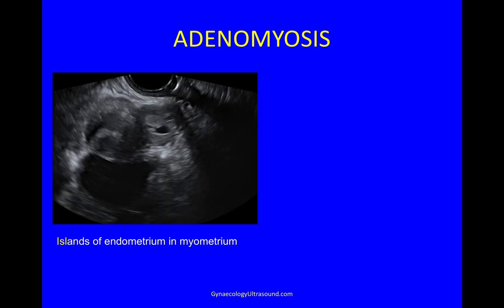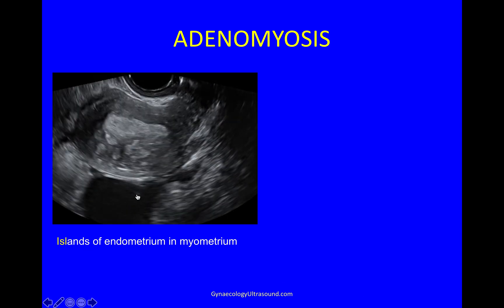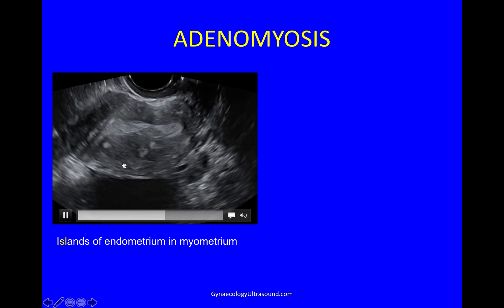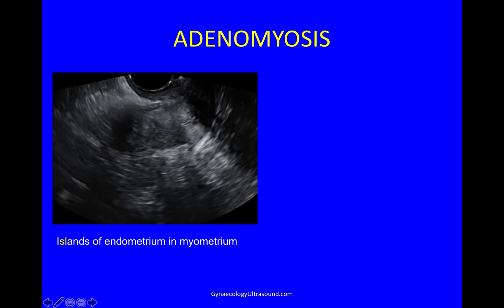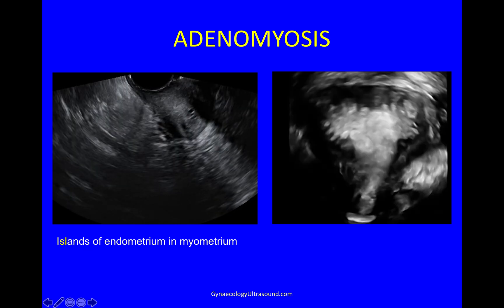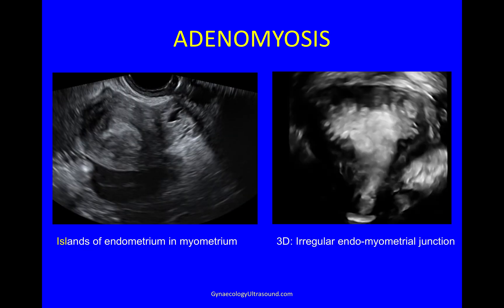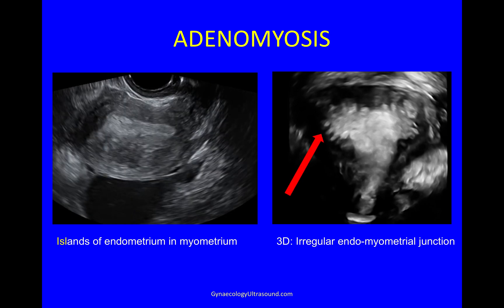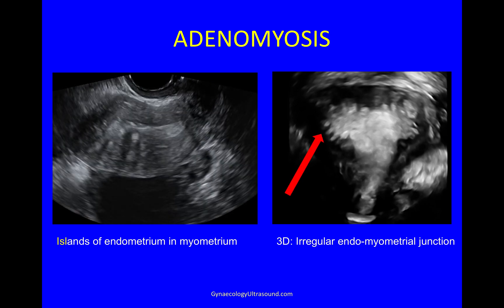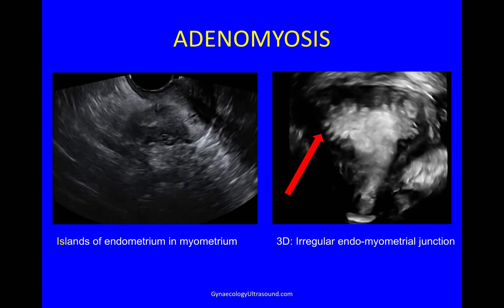In some cases of adenomyosis, you can see islands of endometrium in the myometrium, and on 3D you see an irregular endomyometrial junction with budding of the endometrium into the myometrium.